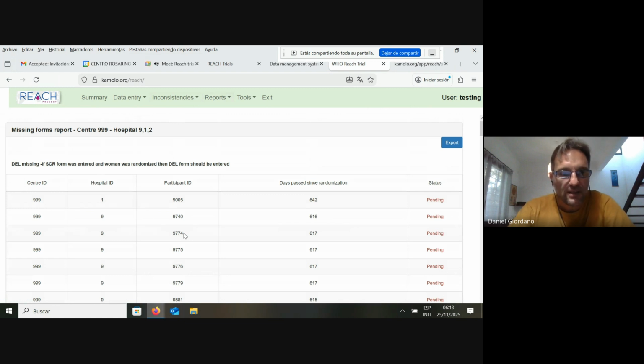So this is a very important report that we strongly recommend to review periodically.